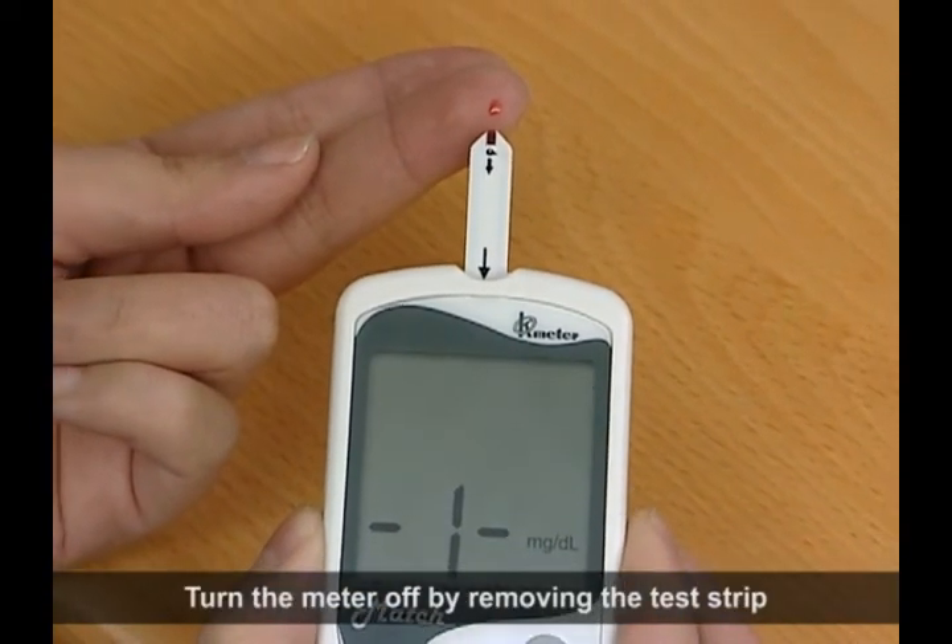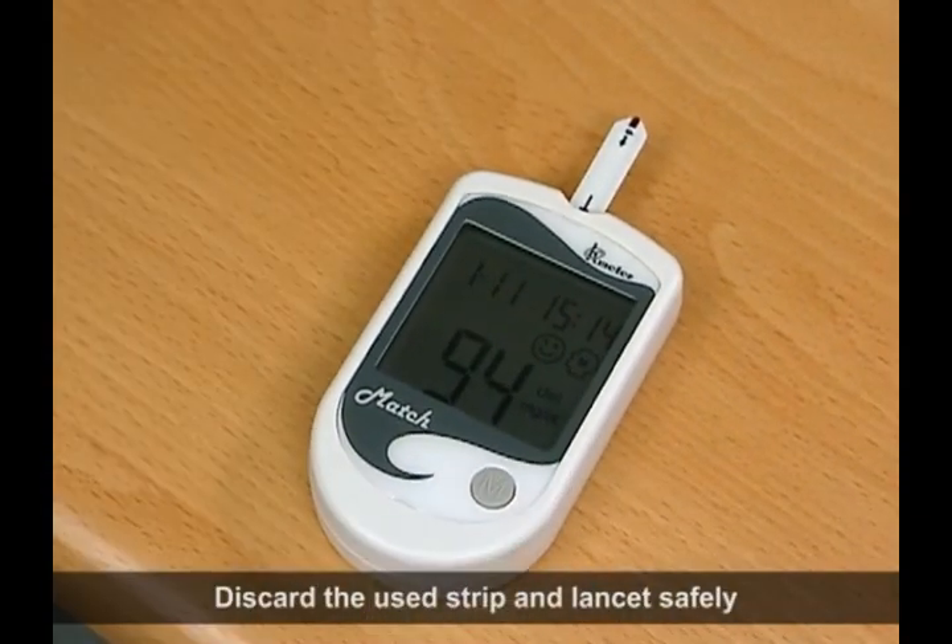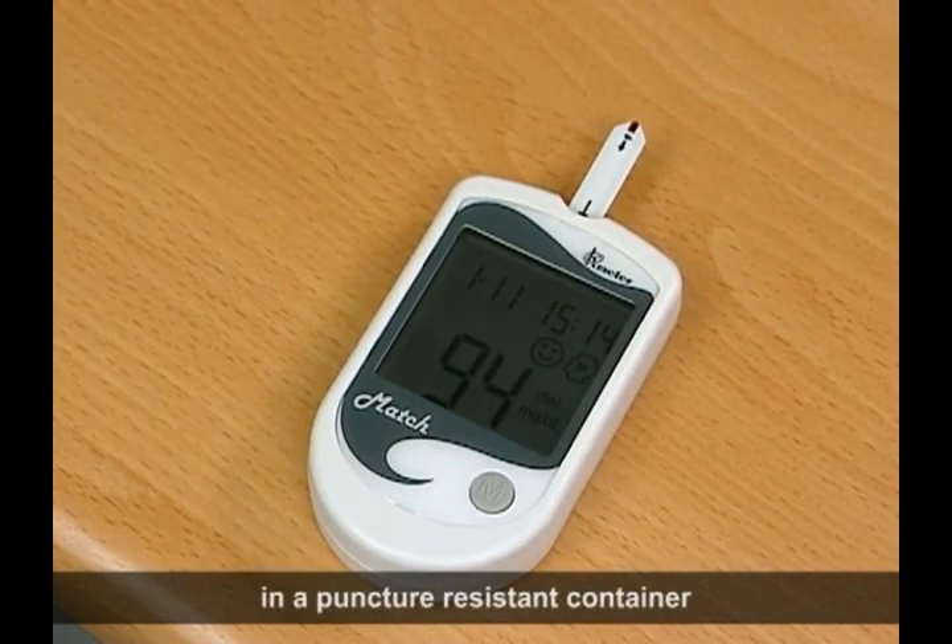Turn the meter off by removing the test strip. Discard the used strip and lancet safely in a puncture-resistant container.